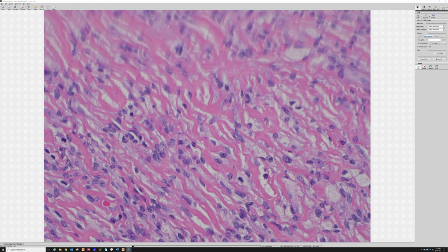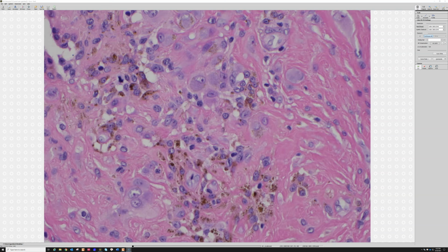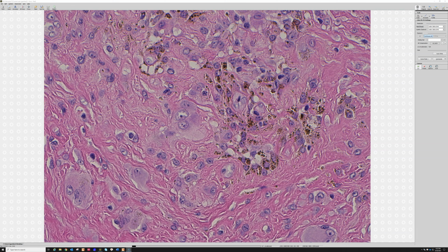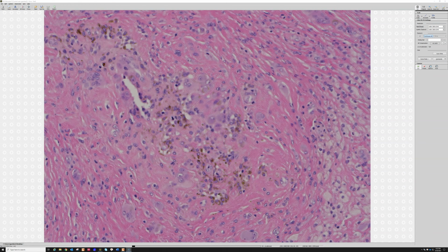So we've got foamy histiocytes, sclerotic collagen. Oh, we also have some hemosiderin deposition here, some pigment that's chunky and golden, and when I flip the condenser, you can see it's very refractile. So that's characteristic of hemosiderin. Look at these cells right here.